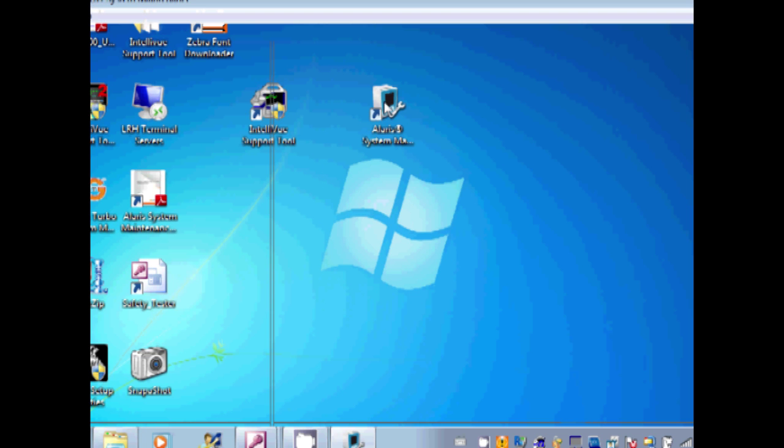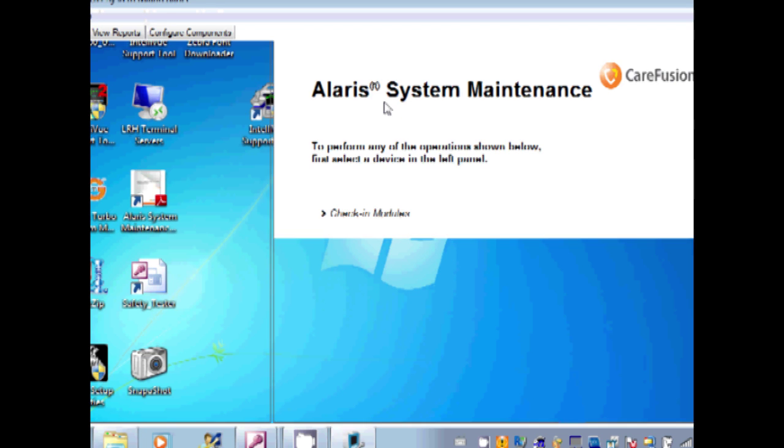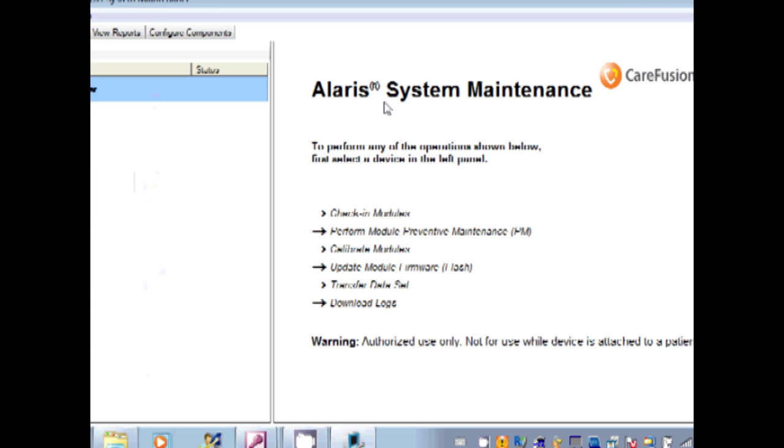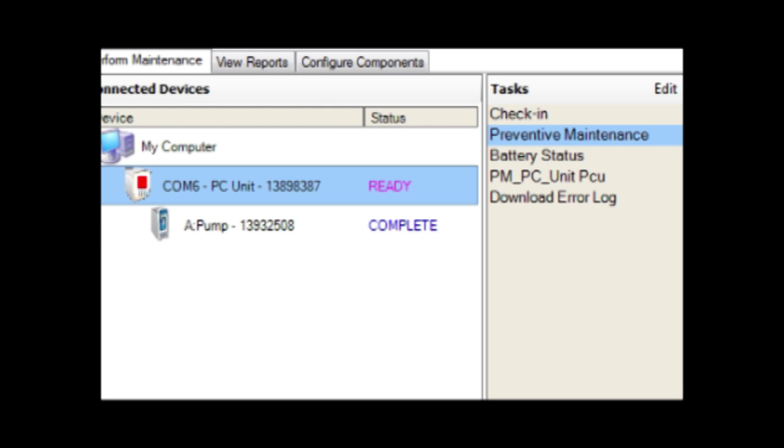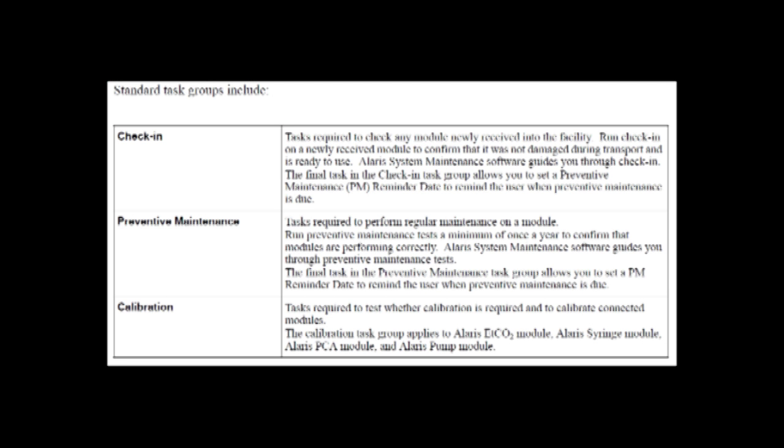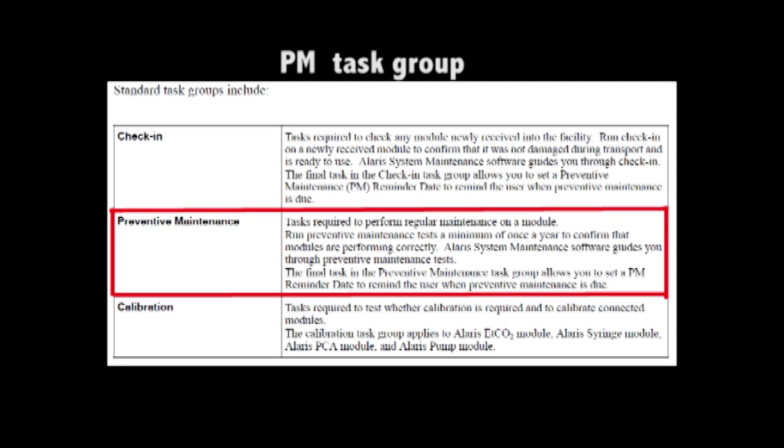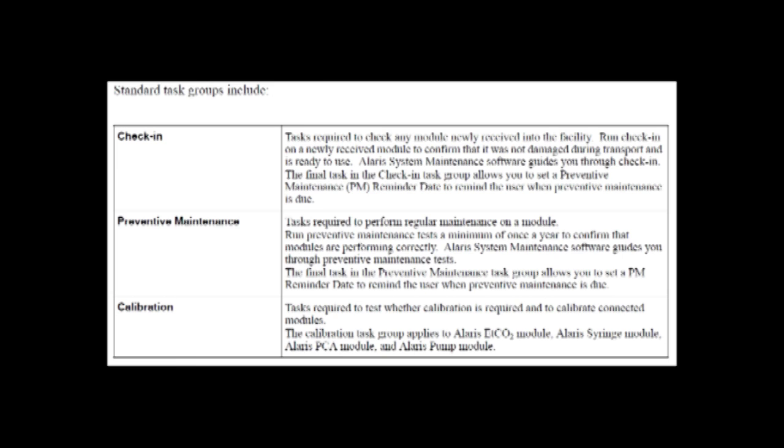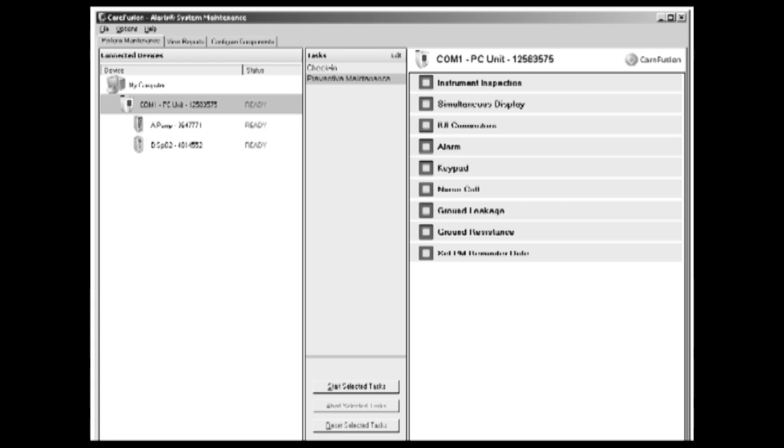So this is the software starting up. And the main screen. Today we are going to be looking at the task group under preventive maintenance. We will look at performing preventive maintenance in the task group.